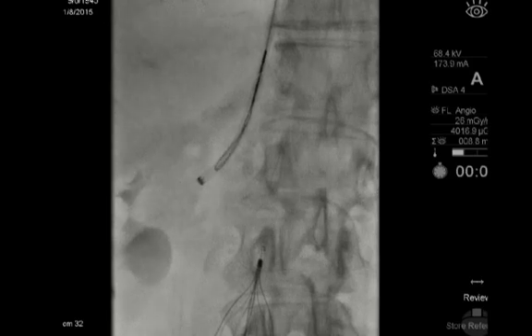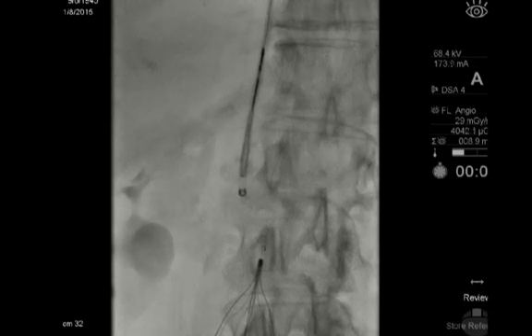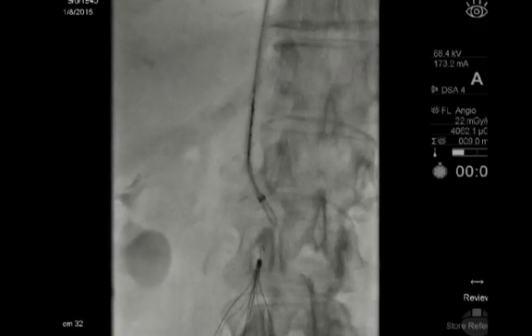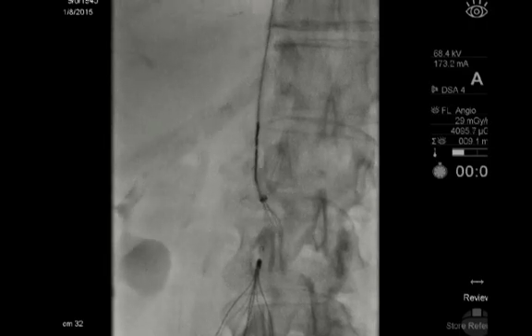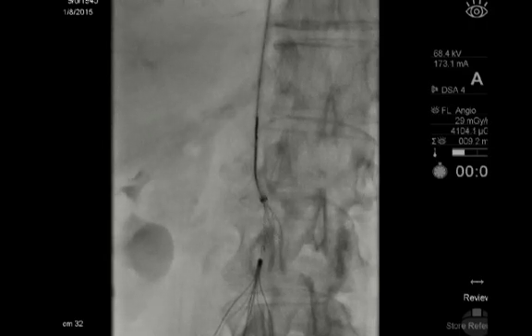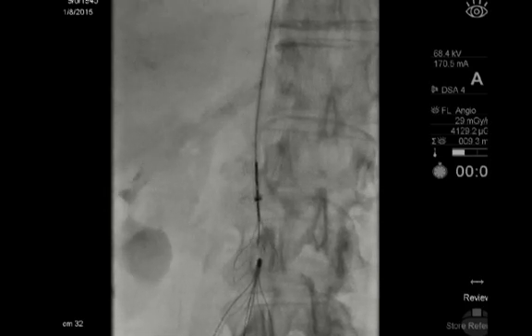Simply by controlling the control module, we can sweep the snare — which is present inside the robotic catheter. We now have the ability to add steerage to an otherwise non-steerable device and direct the snare precisely where we want it to go. Here you can see we're moving it towards the retrieval cone of the inferior vena cava filter. The cloverleaf is then deployed and we use the robot to steer it back into position. We then advance the robot, closing the snare, and check it in two different dimensions to make sure we're in proximity.